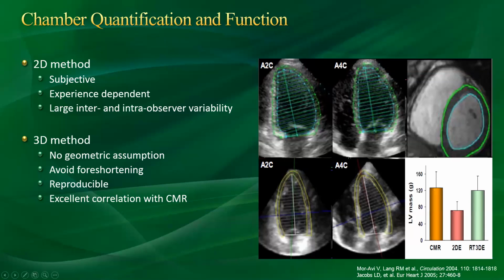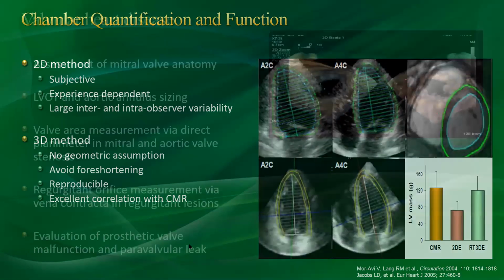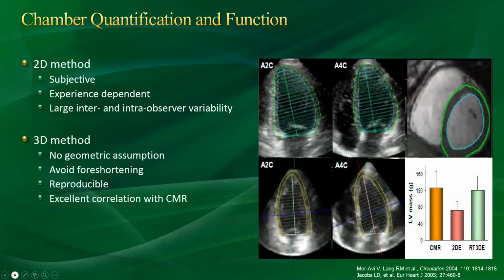And also we can use 3D echo for assessment of the left atrial appendage and for left atrium sizing. For some reason, I lost the slide.